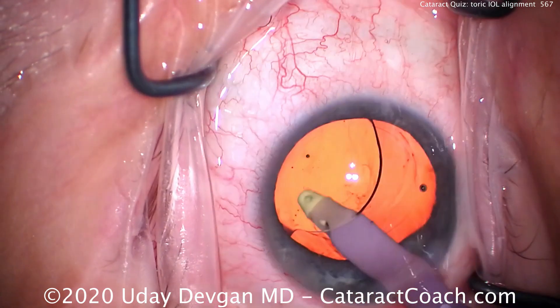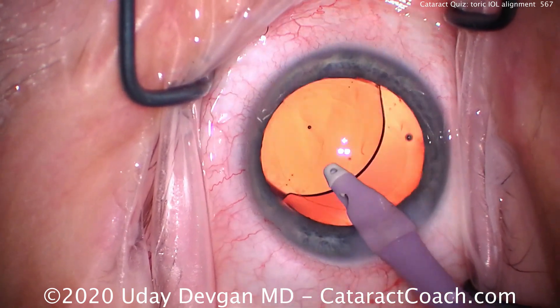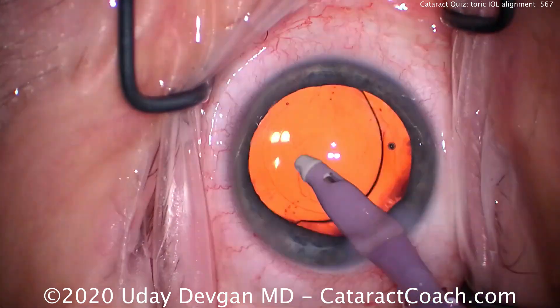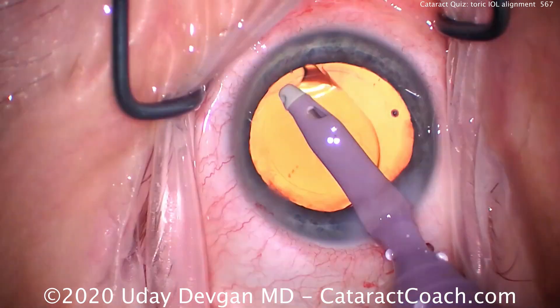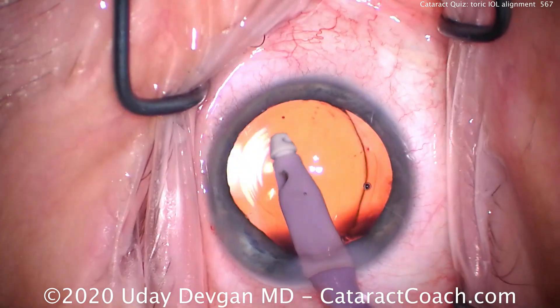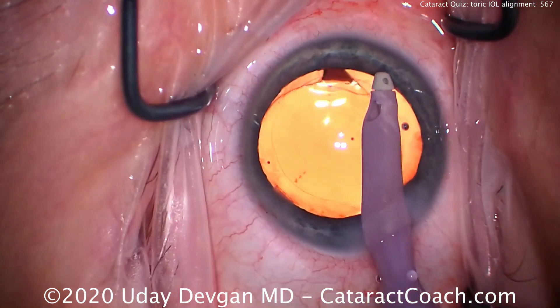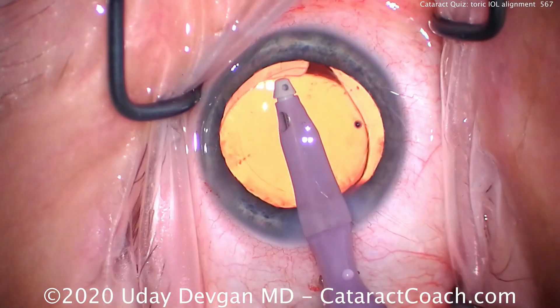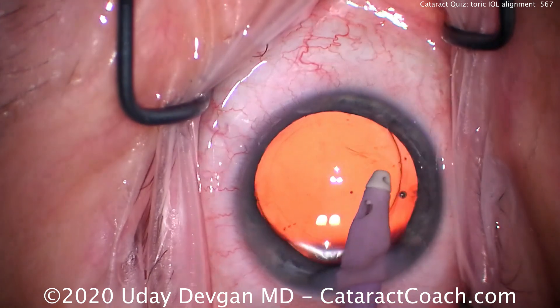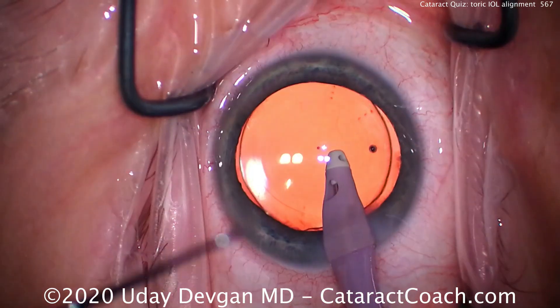It's very important with a toric lens that you remove all the viscoelastic from behind the optic. If you leave viscoelastic back there, it acts as a lubricant and can allow the IOL to shift, spin, or rotate out of position. So in order to keep the lens in good position, you definitely have to remove all that viscoelastic.